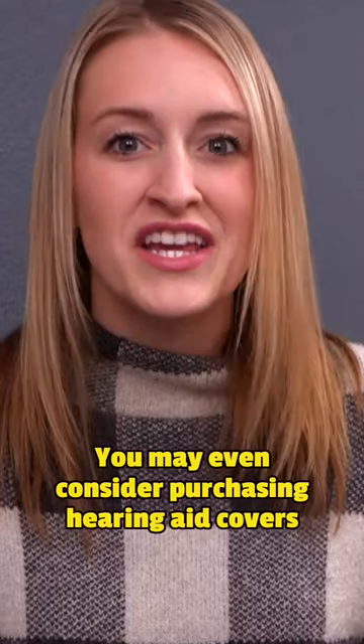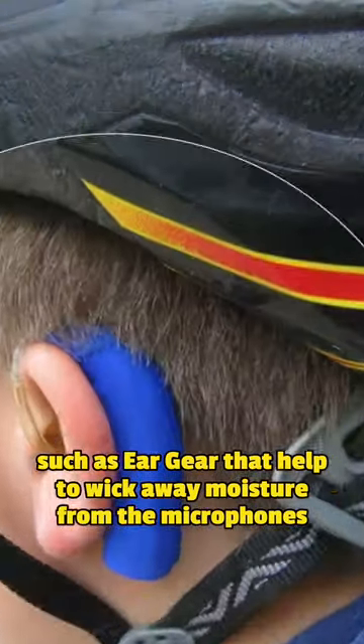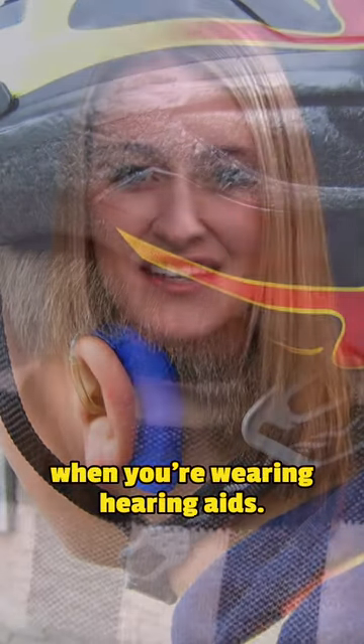You may even consider purchasing hearing aid covers, such as ear gear, that help to wick away moisture from the microphones when you're wearing your hearing aids.